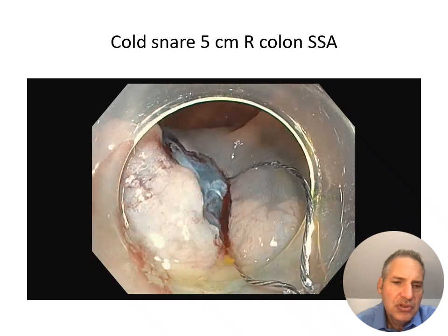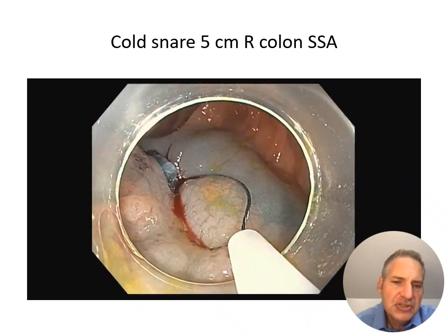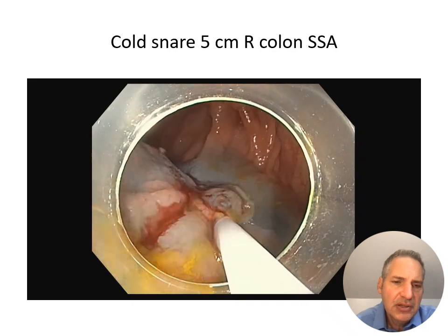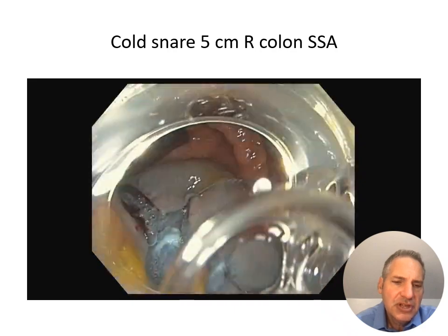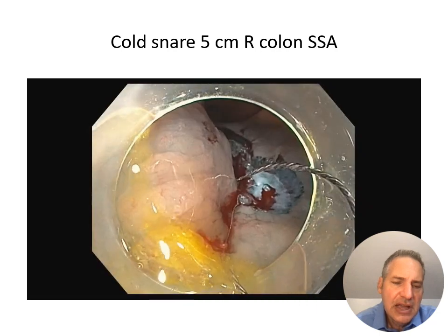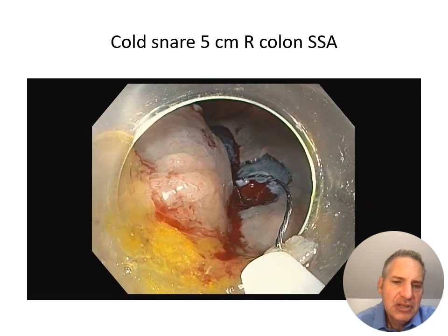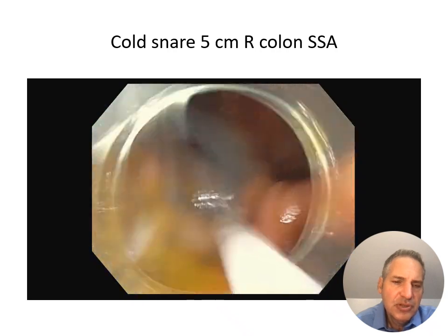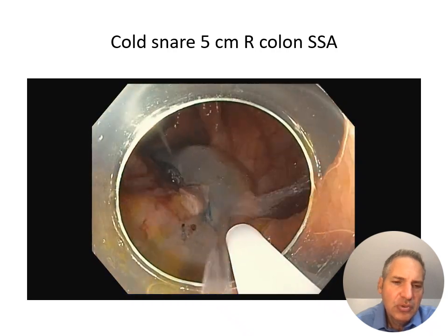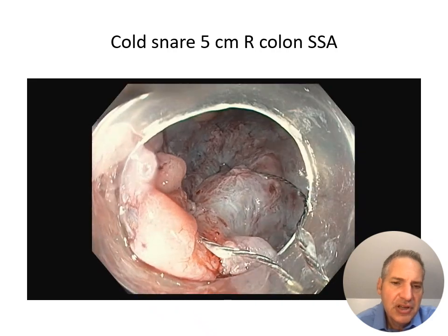Spray some water to maintain the field of view and inspect each cut. Now we're laying the snare down at the next spot, working along the edge of the resection margin and giving that downward pressure to maintain the cut and maintain the snare where it's been placed. Sometimes a little bit of torque will help maintain that downward pressure and achieve a cut.